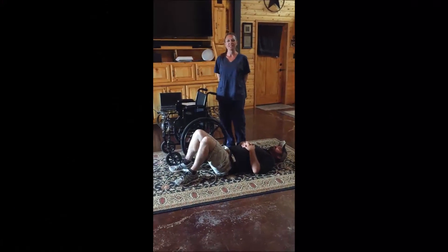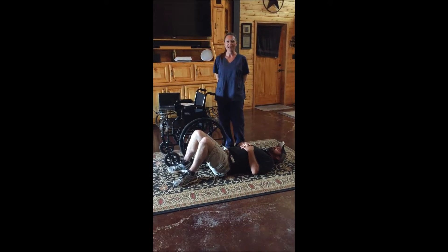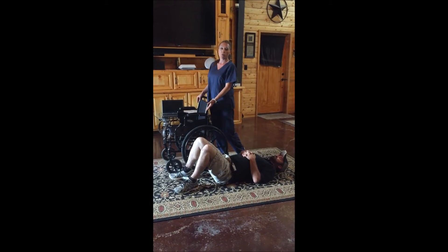Hi, this is Shawna with tips from APT.com and I'm here today to show you how to get somebody off the floor who has fallen, has not hurt themselves, by using a wheelchair.